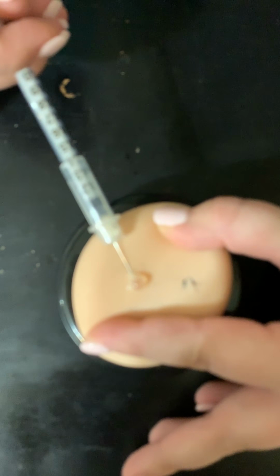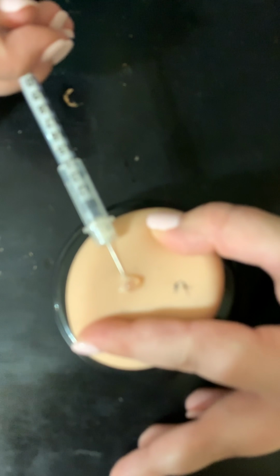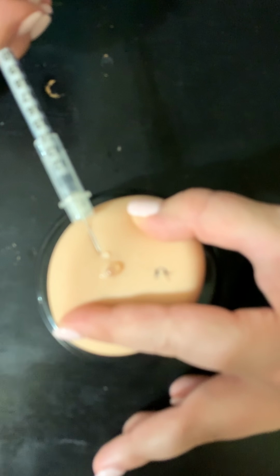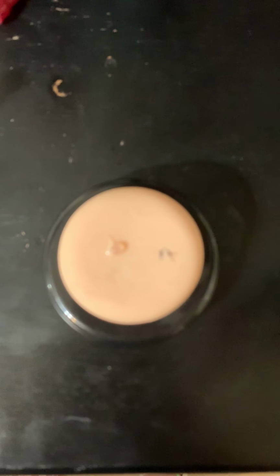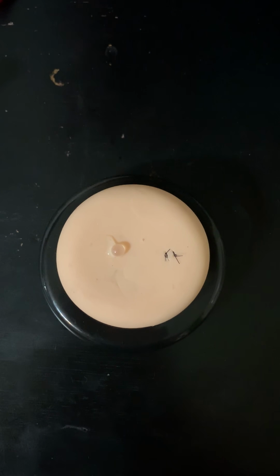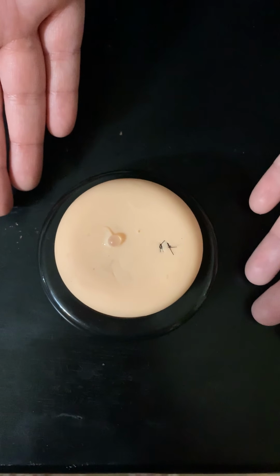That's what we want. Now with that wheal, when that wheal pops up, we want to make sure we withdraw the needle in the same position that we inserted it, like so. So as you can see in my wheal, that is how you administer a TB test.